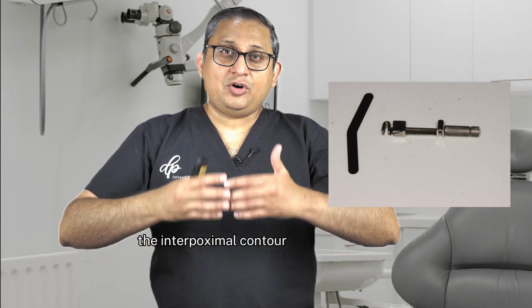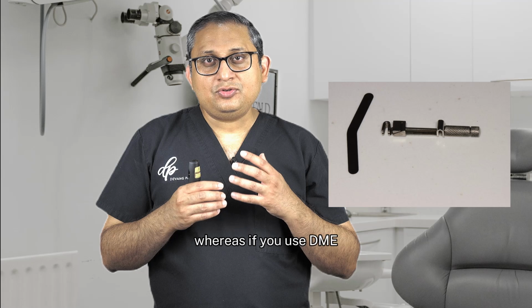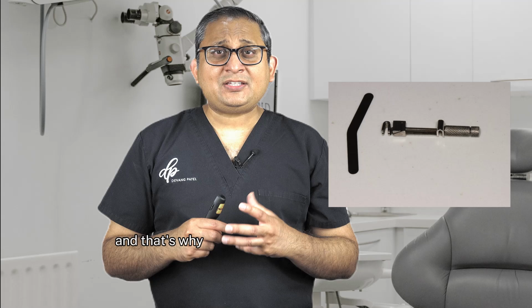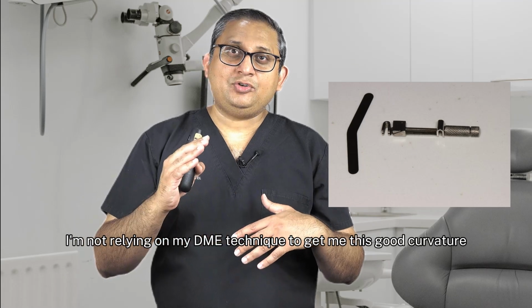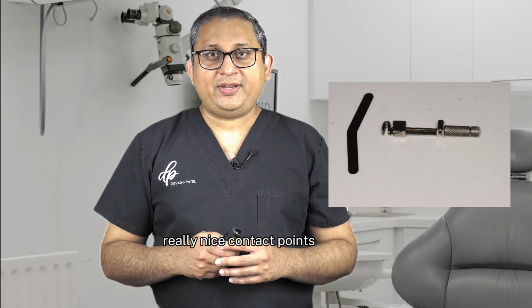The interproximal contour can be really nice and rounded with a sectional matrix band, whereas with DME many times what happens is you can get a somewhat straighter sort of curvature. And that's why I do indirect onlays, and I'm not relying on my DME technique to give me this good curvature. I'm relying on my indirect restoration to get really nice contact points.